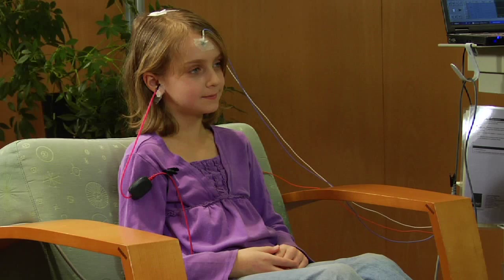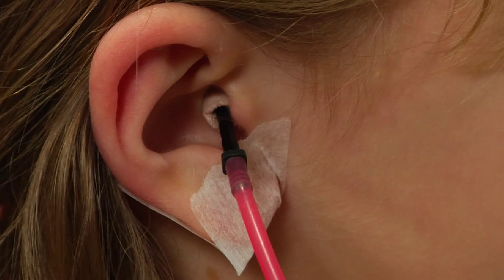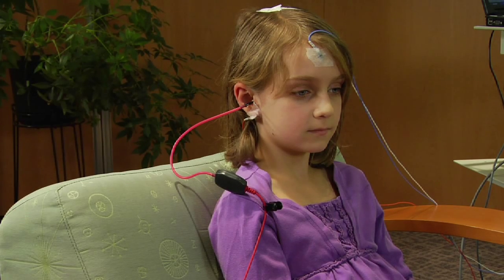The person to be tested sits in a comfortable chair while speech sounds are played in the right ear through the insert earphone. This is what it sounds like.